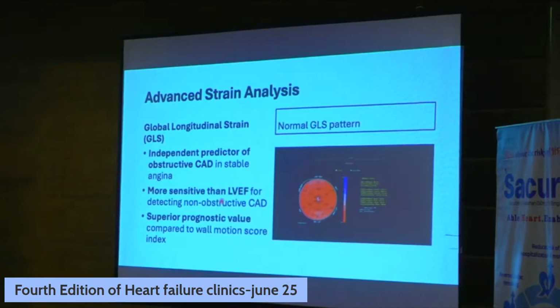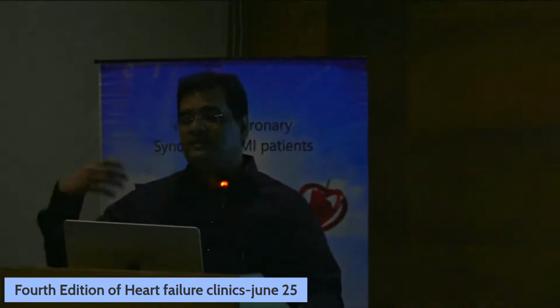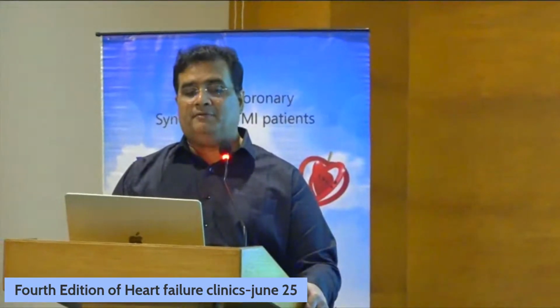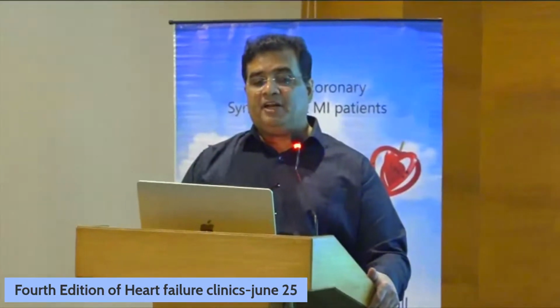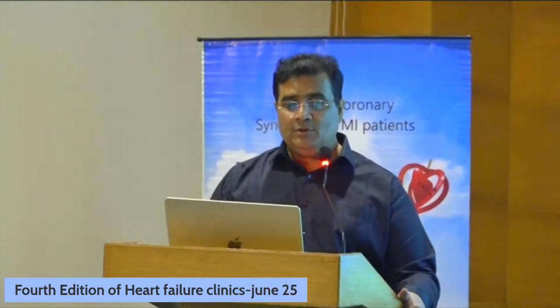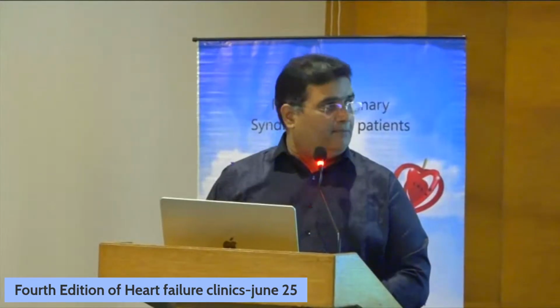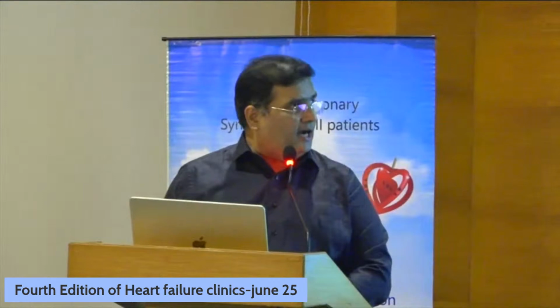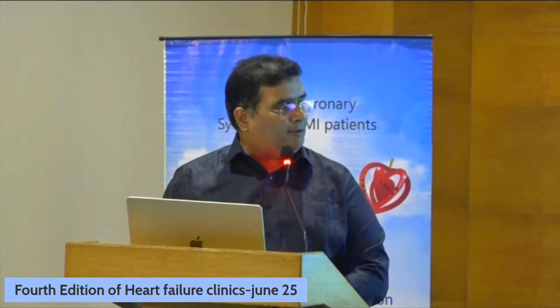And very importantly, for example, if the person has got an obstructive coronary artery disease and there is myocardial damage, then only the ejection fraction would be able to pick up the ventricular dysfunction. But the GLS will be able to detect even non-obstructive coronary artery disease also. So it has got a superior sensitivity as well as a superior prognostic value. Now let us look at a couple of images of ischemic dilated cardiomyopathy, that means there is a coronary hypoperfusion, whereas non-ischemic dilated cardiomyopathy, where the coronary perfusion is normal.